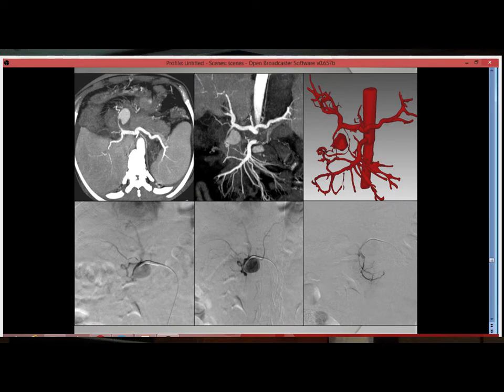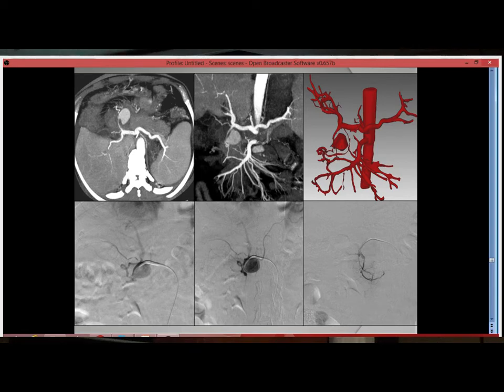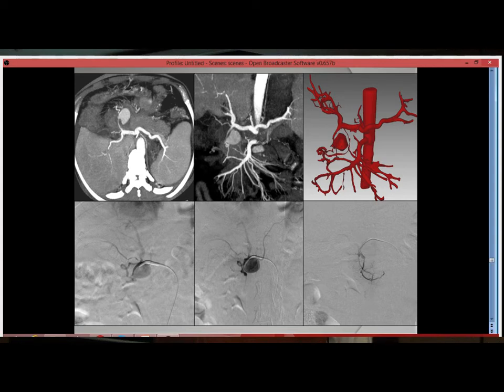The difficulty in these cases remains that if we cannulate selectively and embolize one side, the aneurysm will fill from the other side. So in these cases both the superior and inferior supply must be occluded, so that the pseudoaneurysm is completely knocked off and does not fill again. We can see that it has been cannulated from the superior pancreaticoduodenal branch, with a run taken from the inferior branch clearly showing the pseudoaneurysm, followed by cannulation of the inferior pancreaticoduodenal arcade.